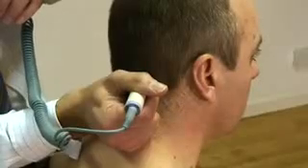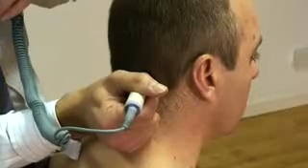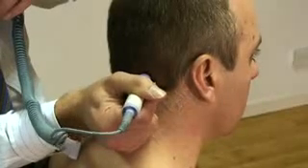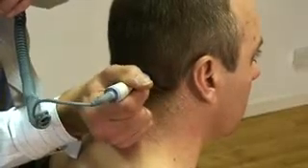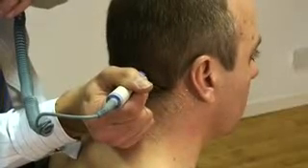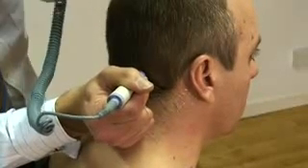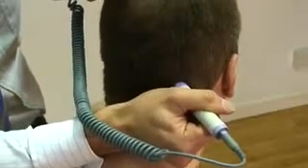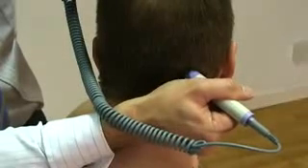The ultrasound Doppler is again being used at the sub-occipital site for the vertebral artery, which is just lateral to the midline underneath the occiput. During cervical rotation the pulse is lost and then searched for again.